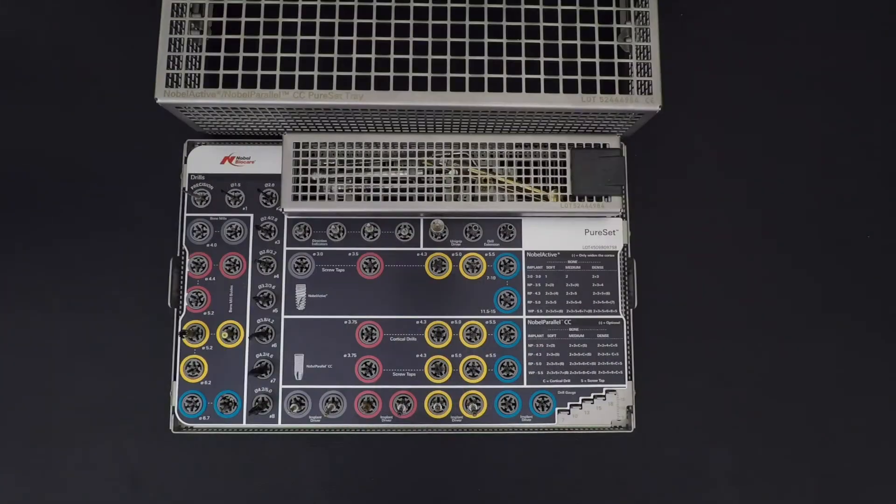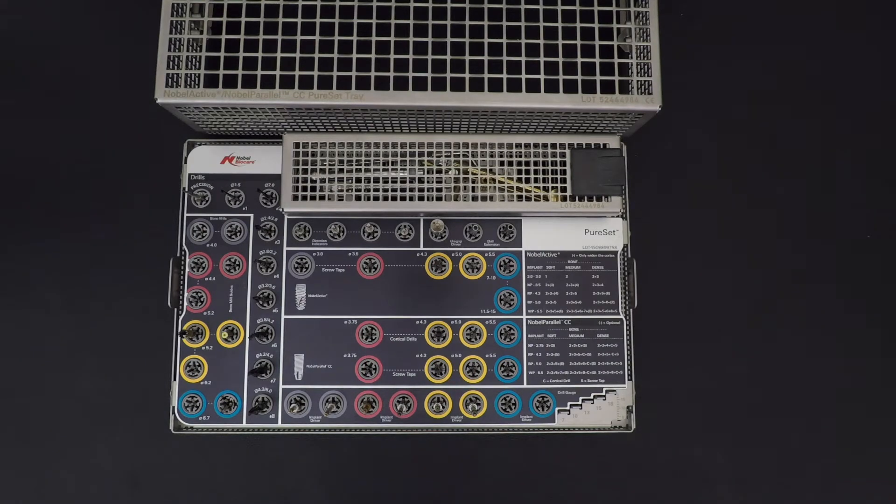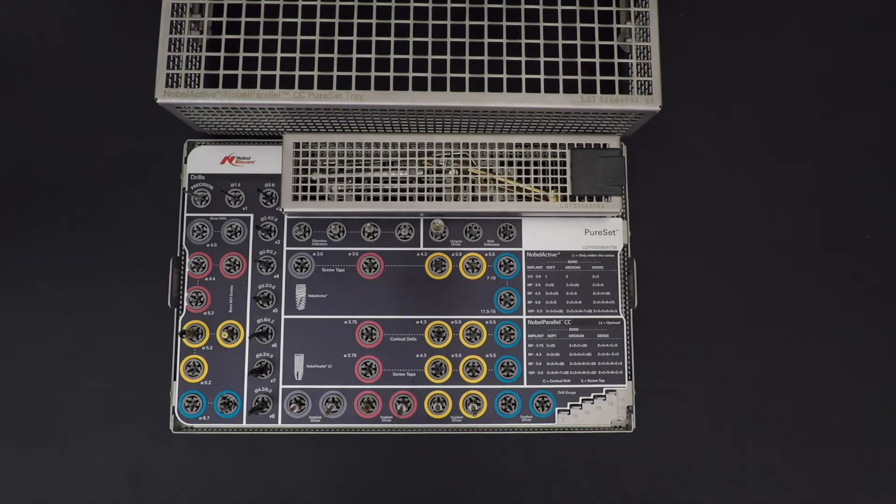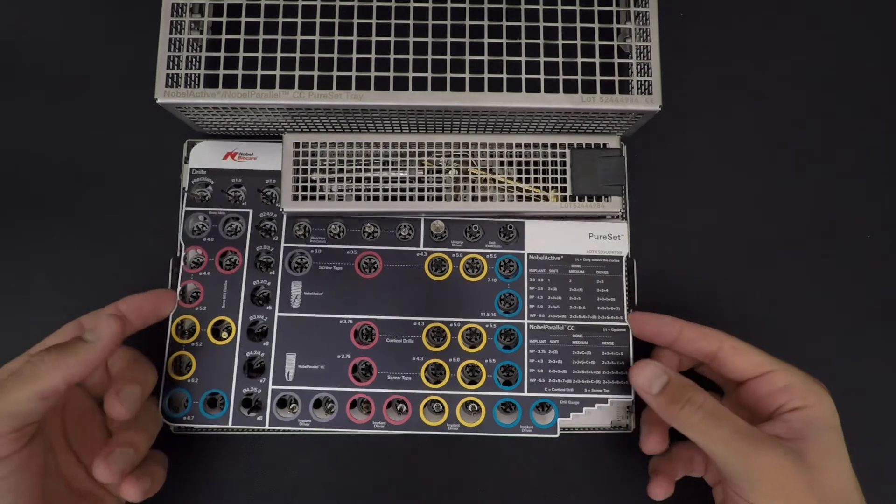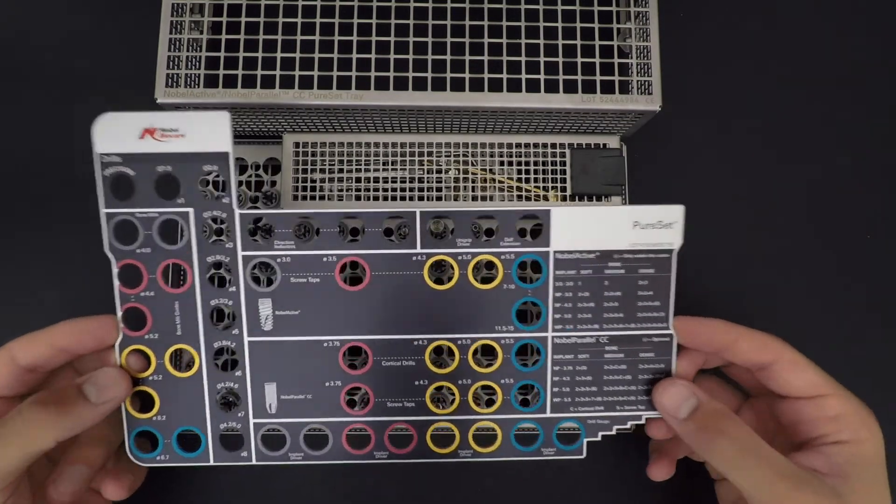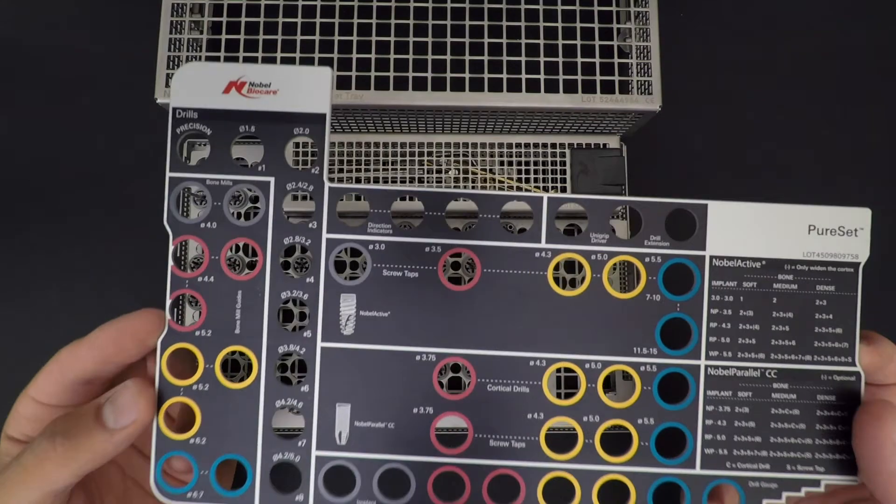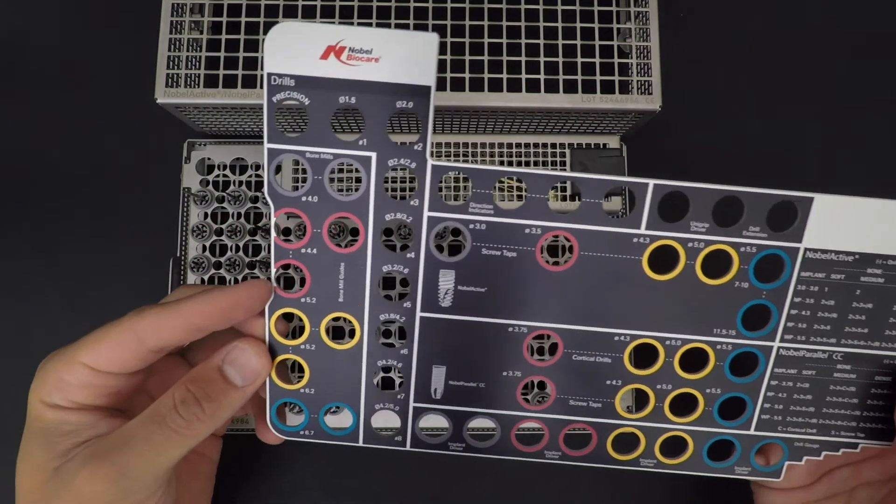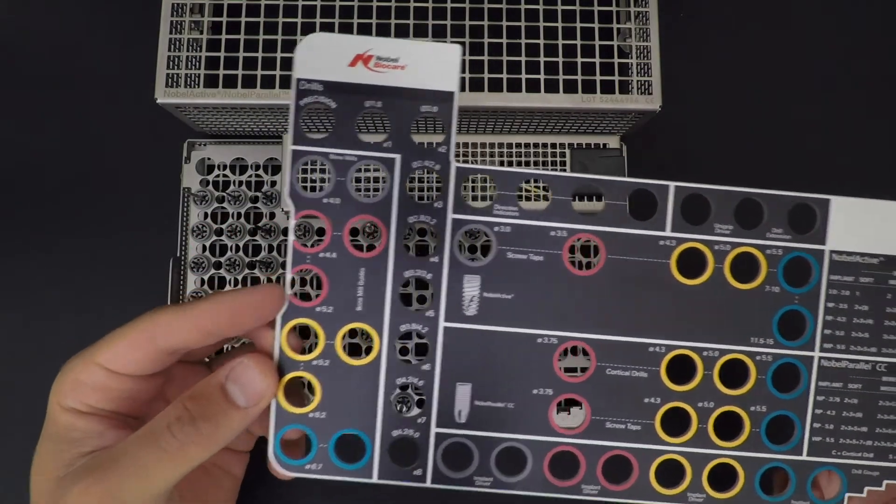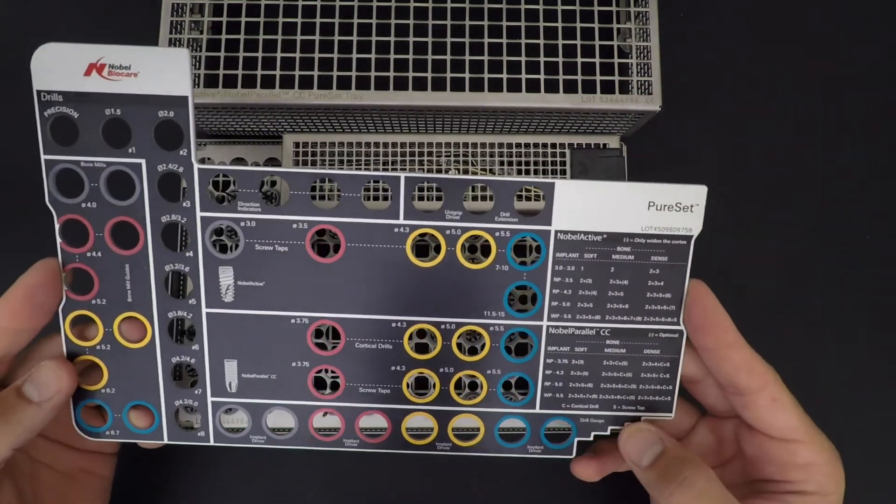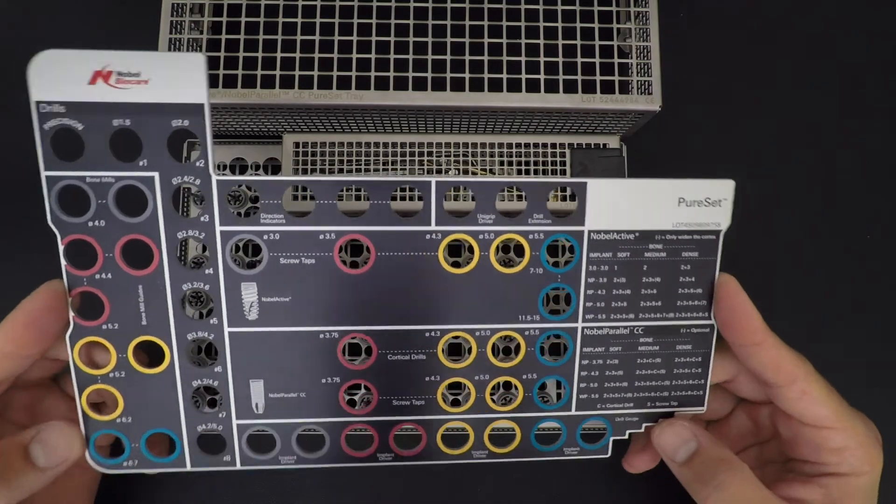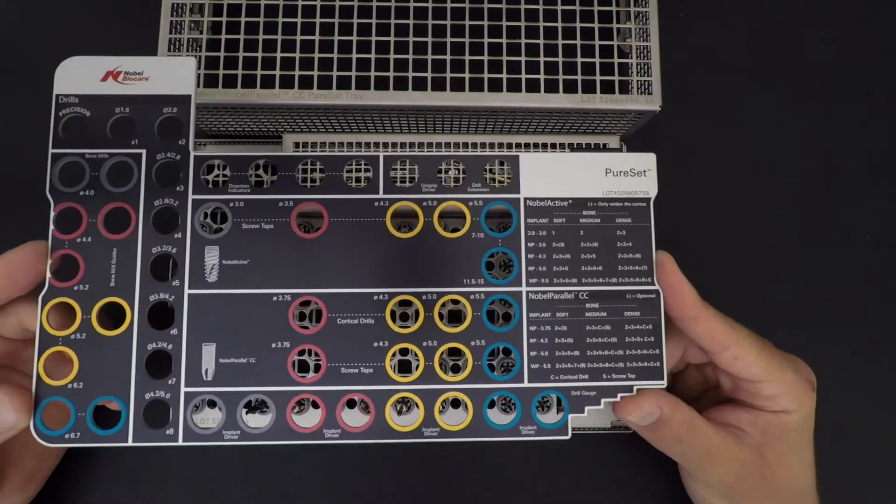There's many components in this one because you can use both systems, Noble Parallel and Noble Active from Noble Biocare. First, you get your plate with all the important information about your implant, your drills, your drill sequence, and the protocol depending on the density of the bone.